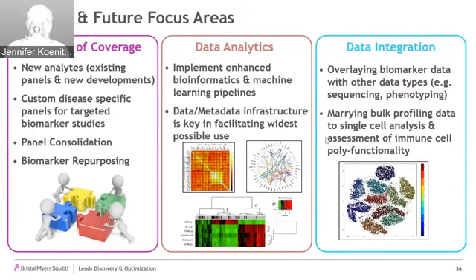Finally, we also spend a lot of effort in 2 closely related areas, data analytics and data integration. I have shown you that we profile tens of thousands of samples a year across a wide variety of experimental designs. With that comes a strong need for data management and, more importantly, metadata management, so all the data can be applied for the widest possible use.